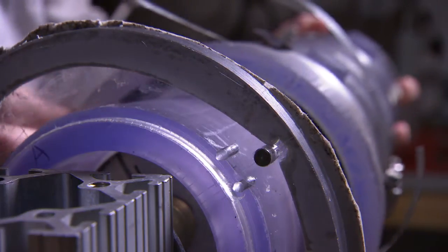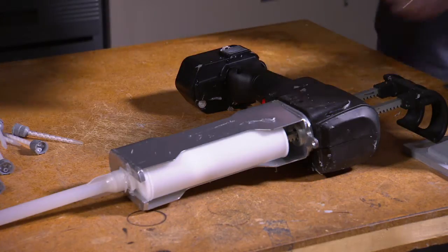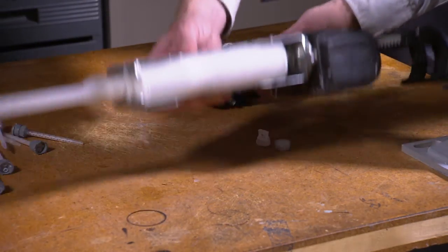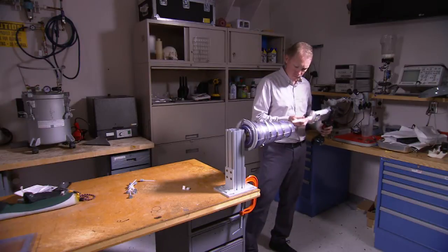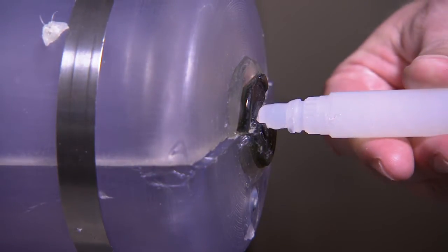if it wasn't comfortable to the person, they wouldn't use it. When a person has a leg amputated, we can replace a lot of that functionality with a prosthetic device, and the technology is very good, but it still doesn't fully replicate the function of the intact limb. So there are several problems that people experience with the prosthesis.